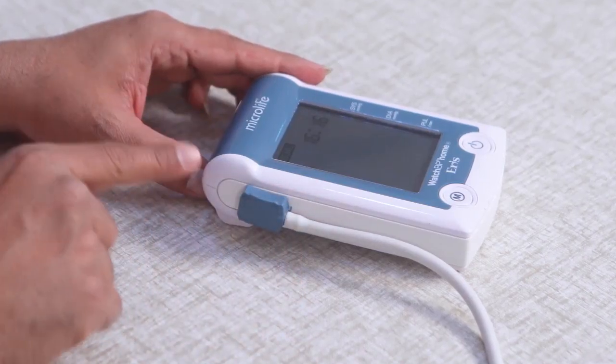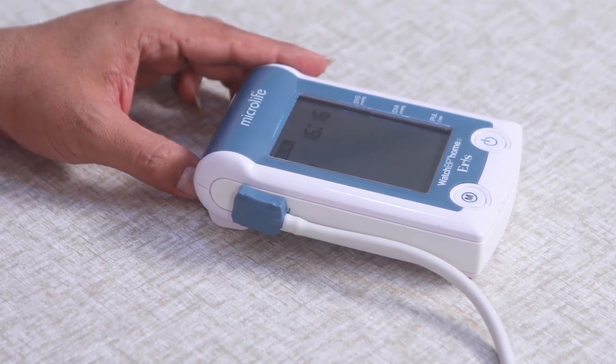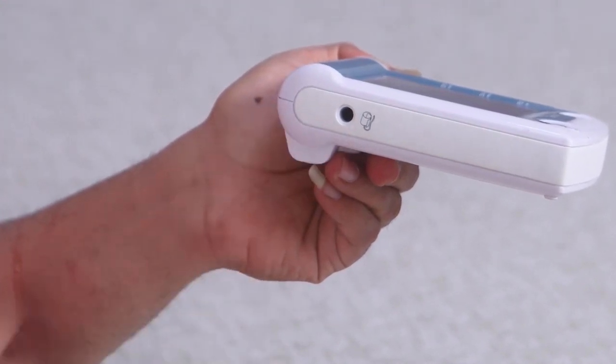Now, observe how the wire is connected to the machine. This is called the connector. The connector is connected to the device through this hollow space.